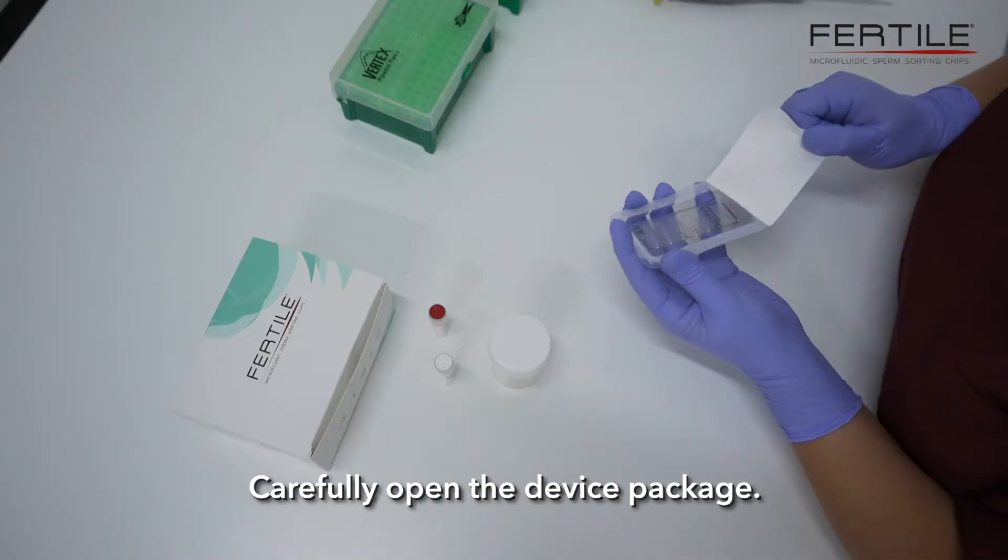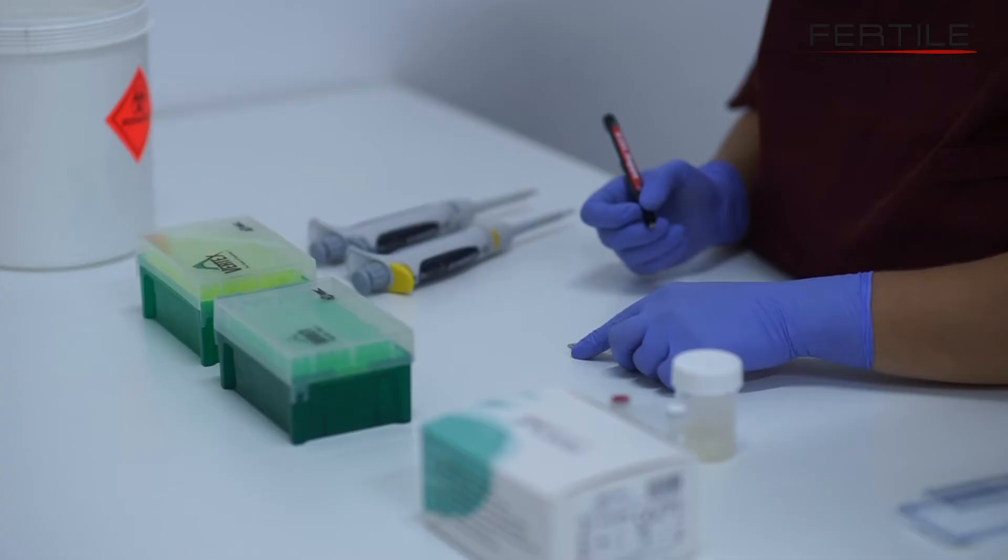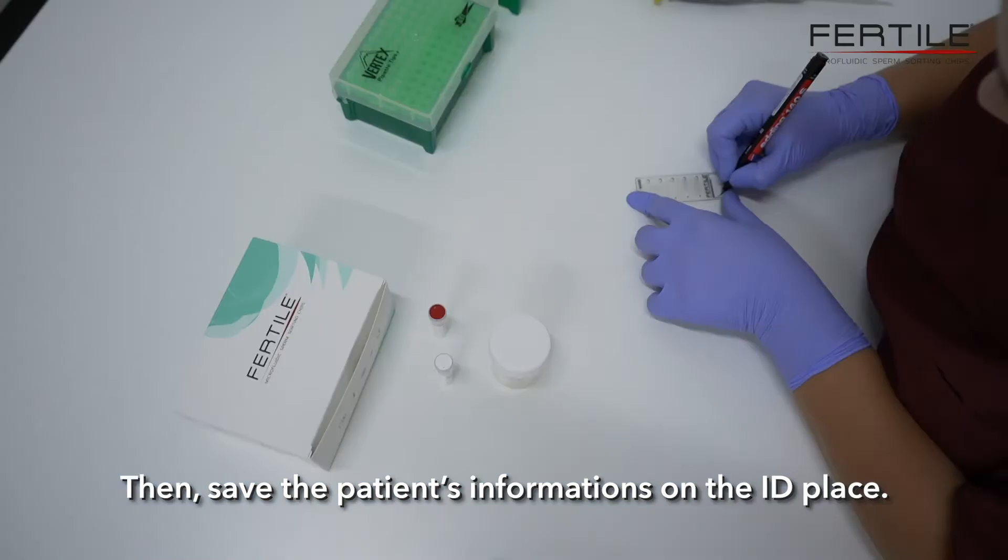Carefully open the device package, then save the patient's information on the ID plate.